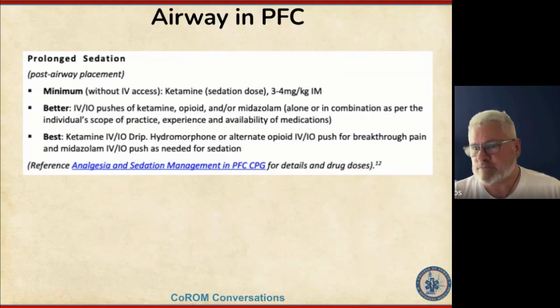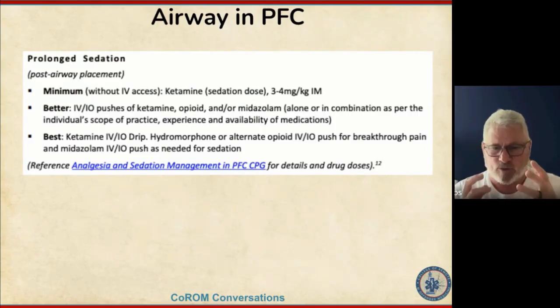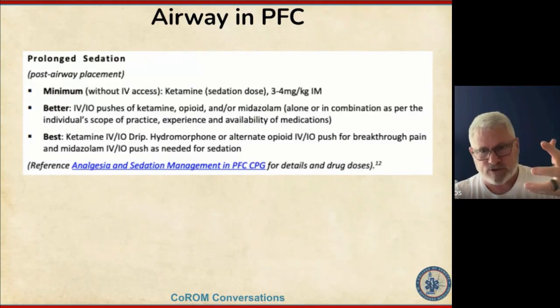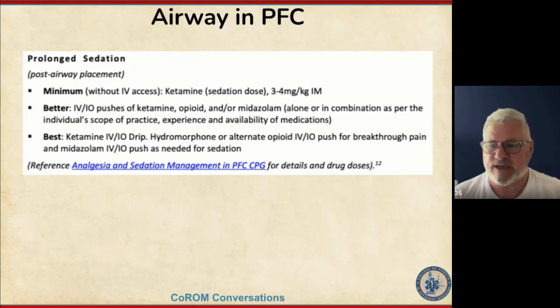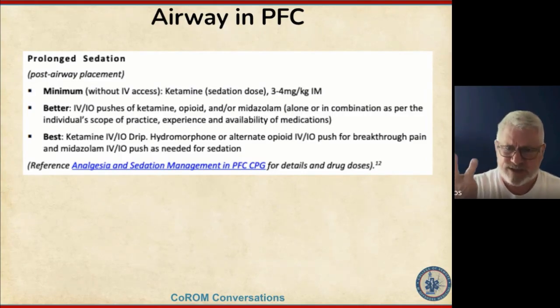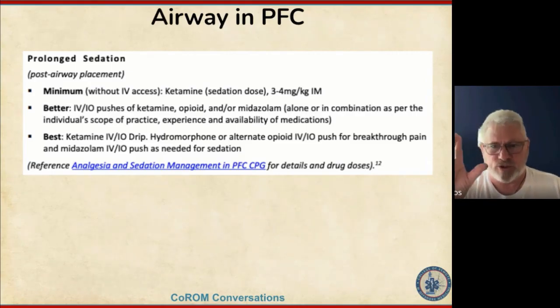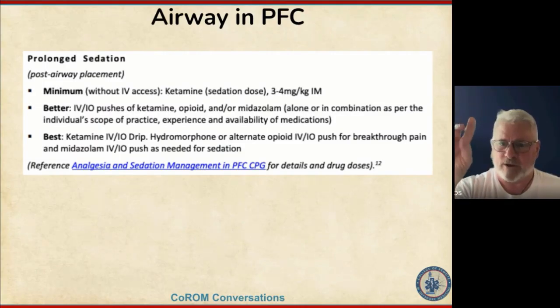I think we talked about positioning, maintaining a good seal using the E to hold the jawline in position and the C to maintain a good seal with the mask on the face. We didn't talk about hand position, and it's not mentioned in the CPG. You should be holding the bag with your palm up. The bag should sit in your hand, and you should use your middle and ring finger and your thumb to just bring those two together.